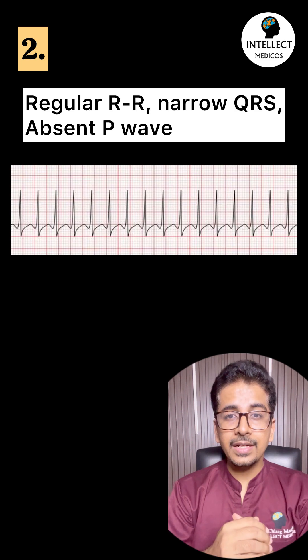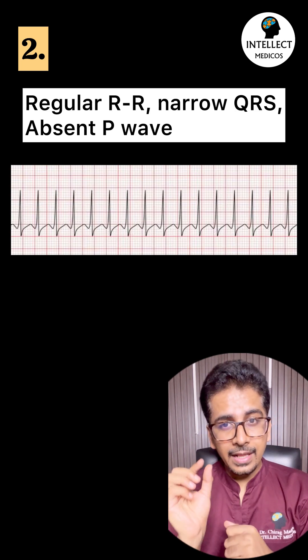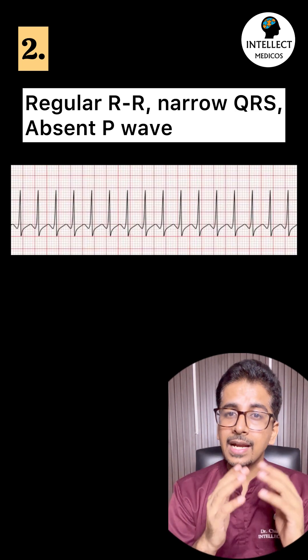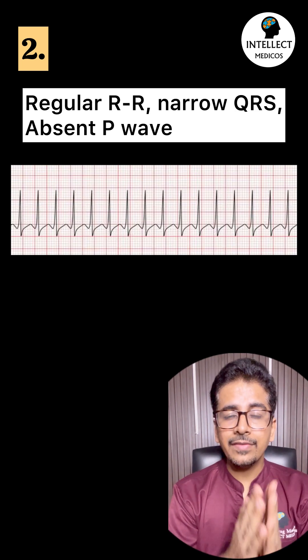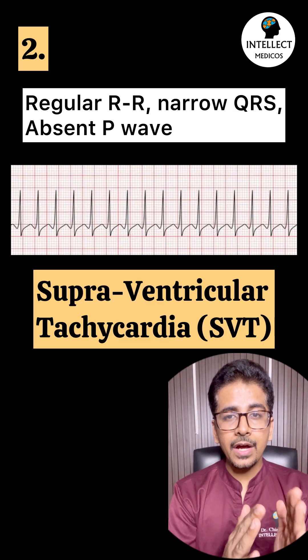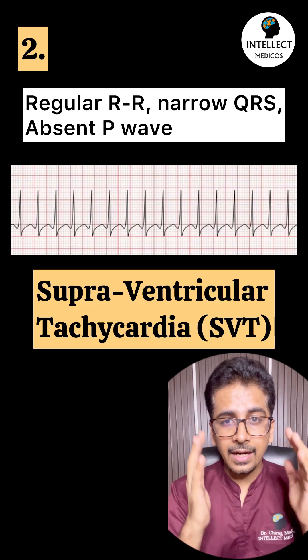Second: regular RR interval with narrow QRS and absence of P-wave. This is supraventricular tachycardia.